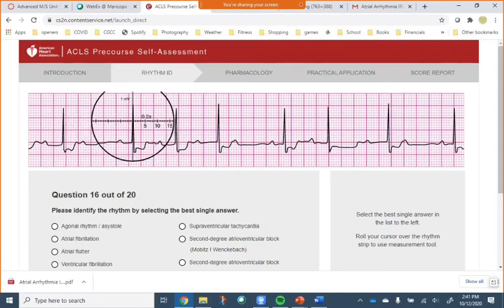The only reason I'm not voting for 3rd degree on this one is because this one looks like this is the whole, half a diameter of that circle. This one's half a diameter of that circle. This one's longer, so it's not really regular. This one's half a diameter of that circle. This one's a little longer. So it's not really regular at this point.